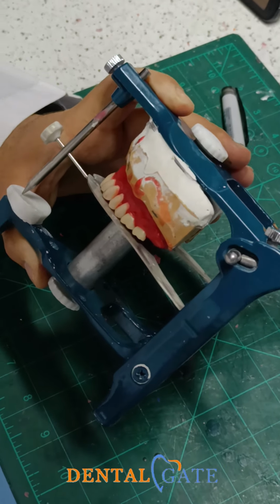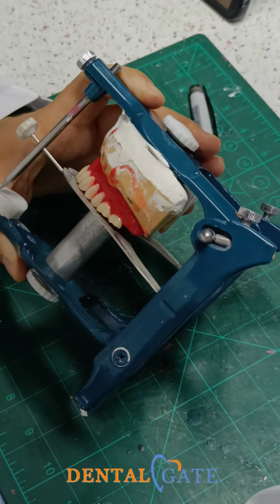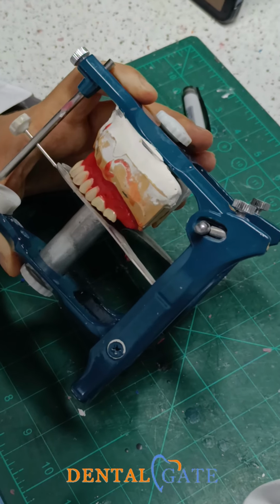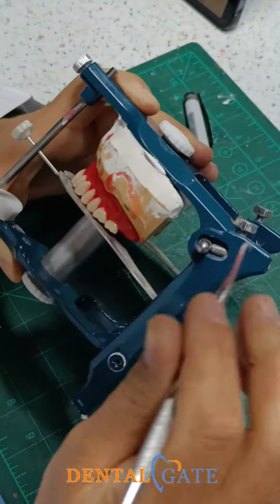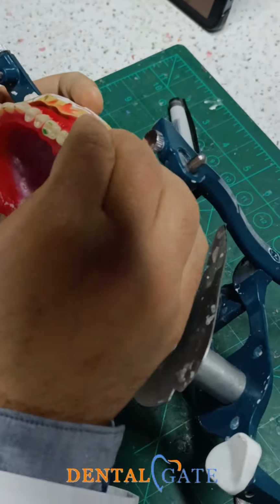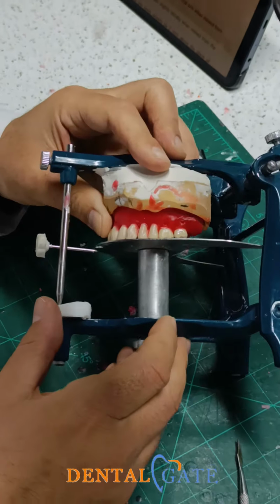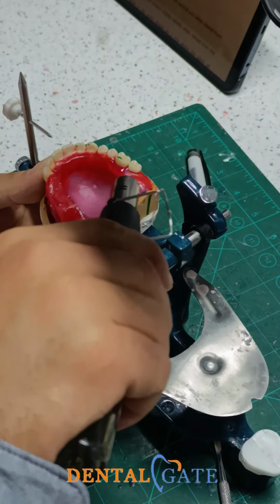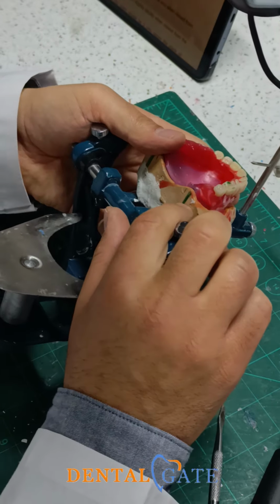But within the complete denture, it's mandatory to make it, because I want to accomplish my objective in complete denture, to perform the balanced occlusion regarding the working side and non-working side, okay? So just keep the tilting without any contact. This is my objective. So the lower 7 should be below the upper one. So this is my mistake.